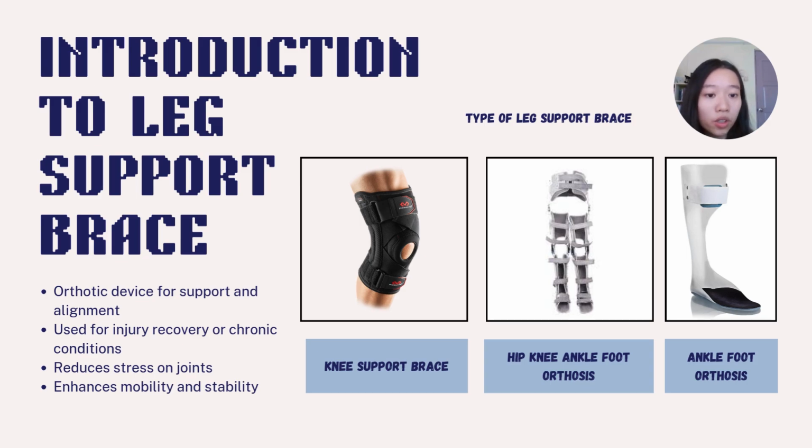Alright, so before we go into what is walking and the theory behind it, we need to understand what is the leg support brace and why we use it for rehabilitation use. So, leg support brace is a medical device for support and alignment. It supports the muscle and joints activity.